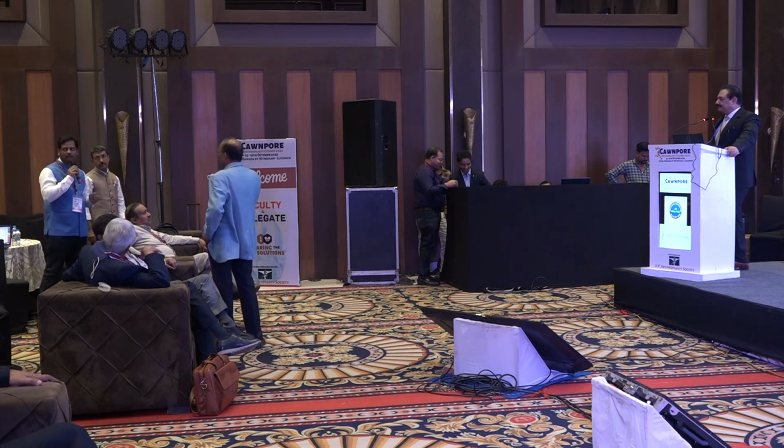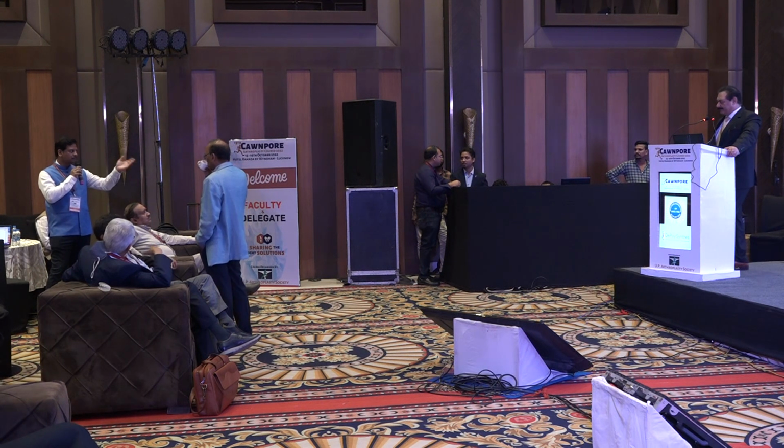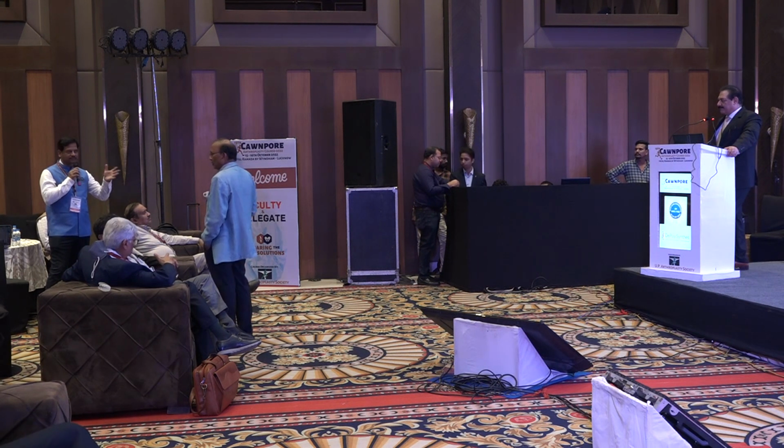Yeah, we should know where you should not use TAL. Acetabulum fracture, dysplastic hip, spinopelvic malalignment, these are situations where you should not go with the TAL.